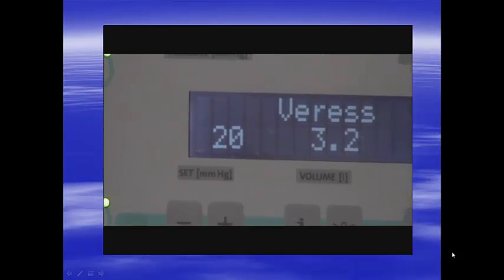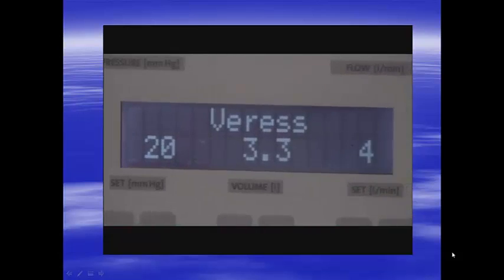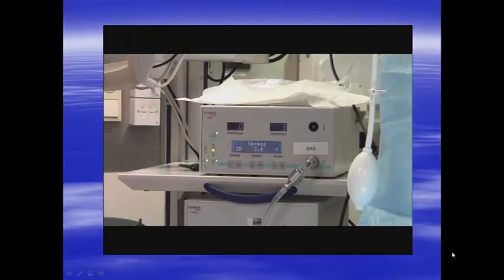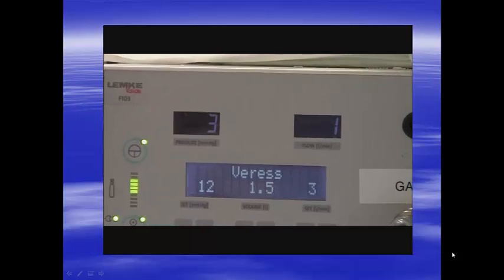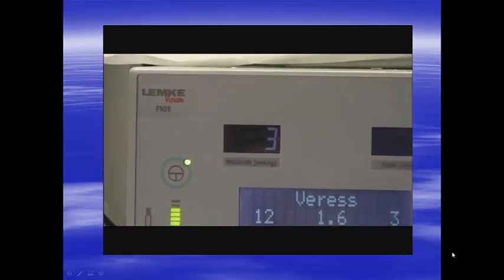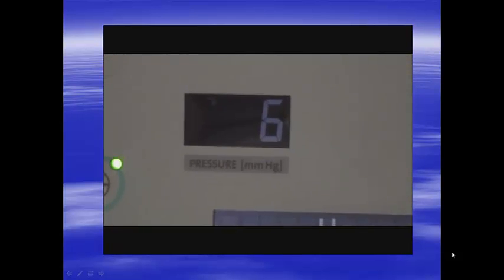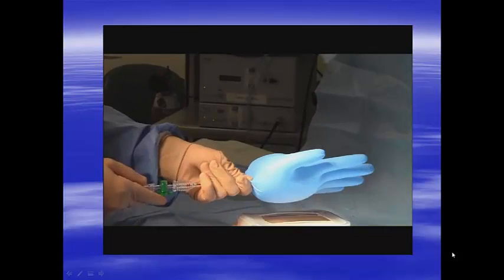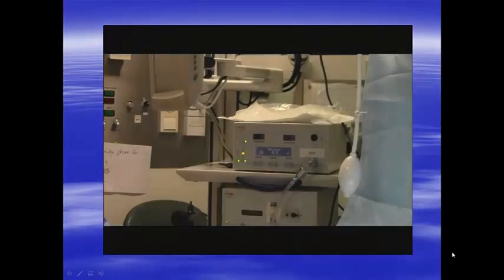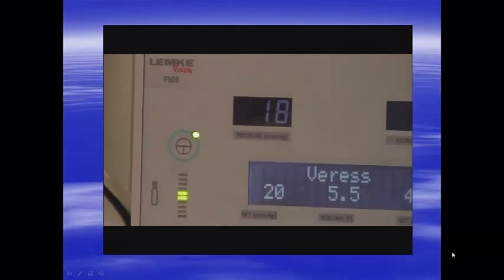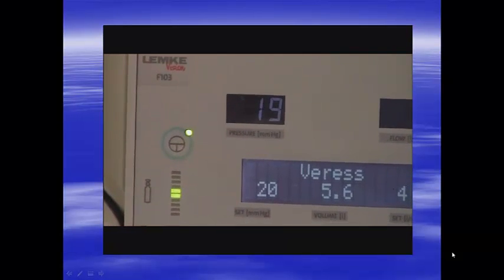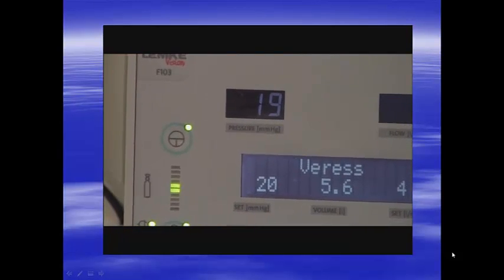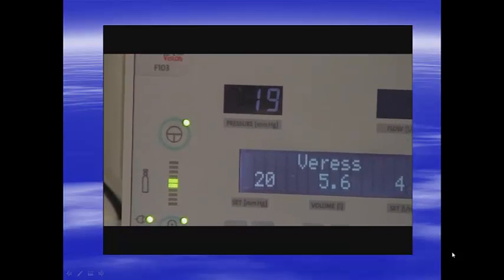We then set the insufflation level to a maximum of 20 mmHg. Carbon dioxide gas is insufflated into the abdomen at a rate of no more than 1.5 to 2 liters per minute. As the carbon dioxide gas is insufflated slowly towards the maximum level of 20 mmHg, we can see that when the maximum pressure is reached, the flow rate automatically falls to zero.